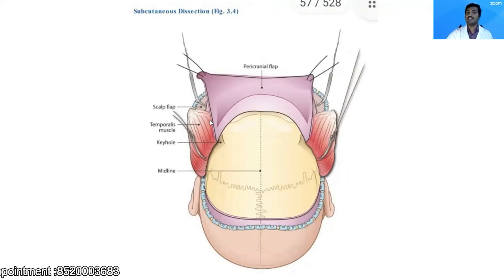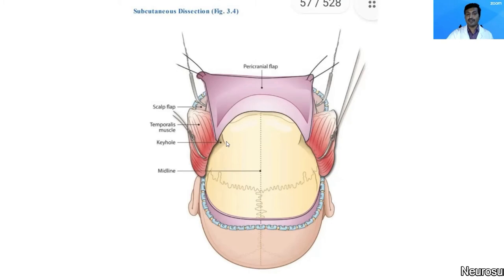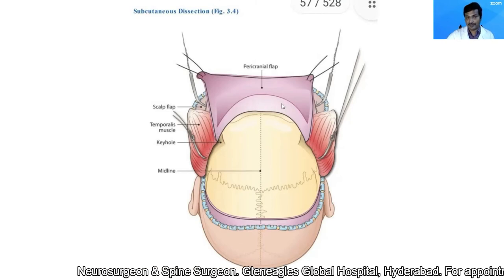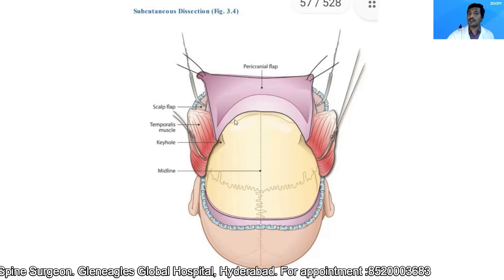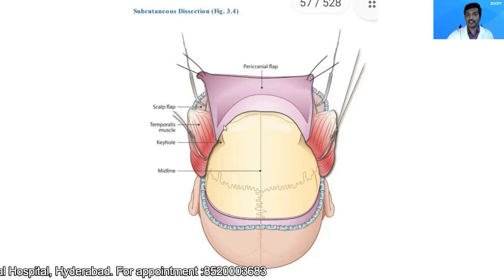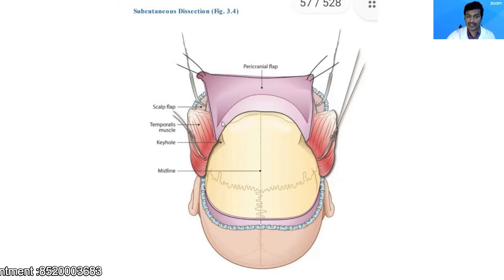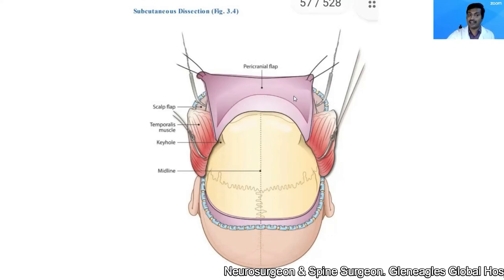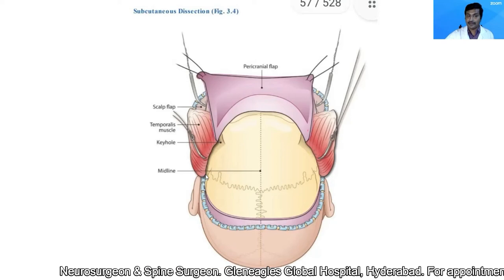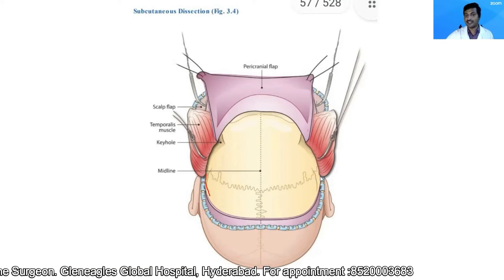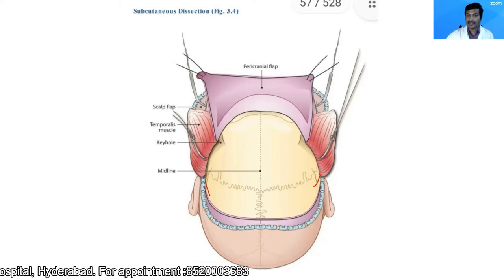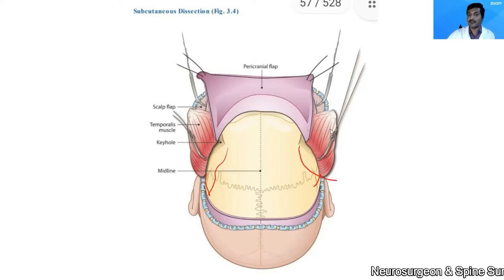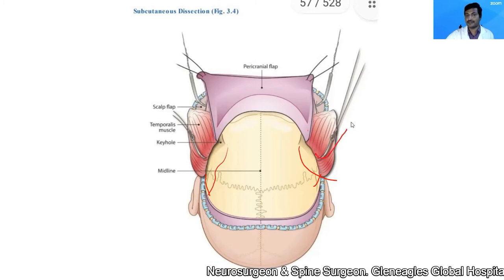Once I reach that level, I use a combination of periosteal elevator and blunt dissectors to elevate the pericranial flap. We take every effort to keep the pericranial flap intact without any holes. If there is a small hole, I suture it back. I cut the temporalis muscle at the posterior extent of the incision, detach it from the superior temporal line on either side, reflect it anteriorly, and hold it with fish hooks.